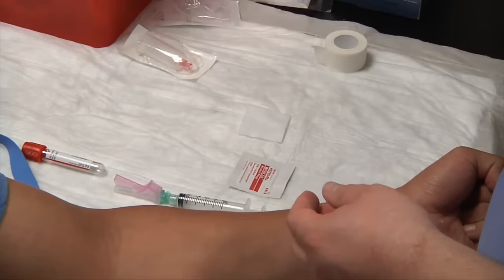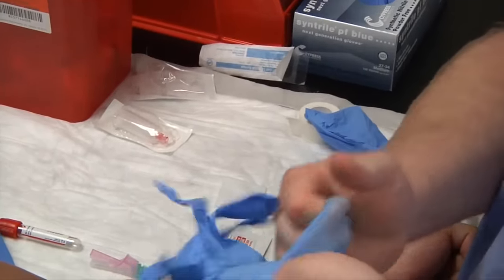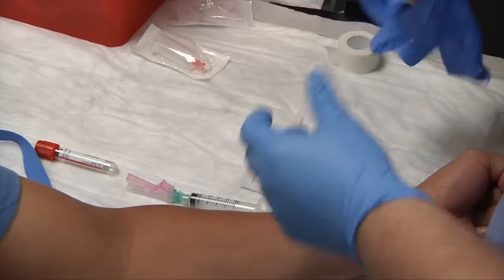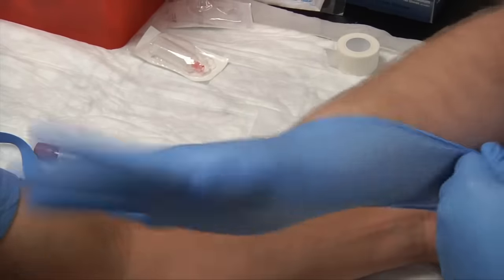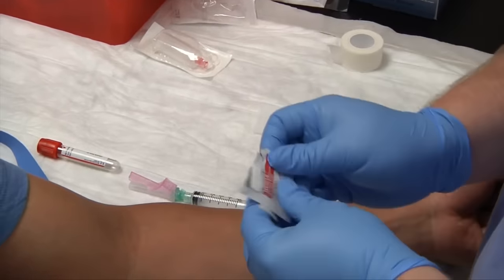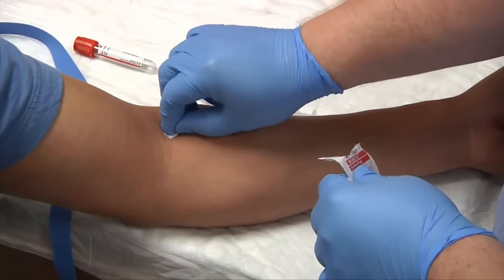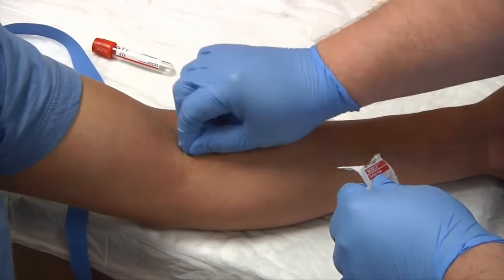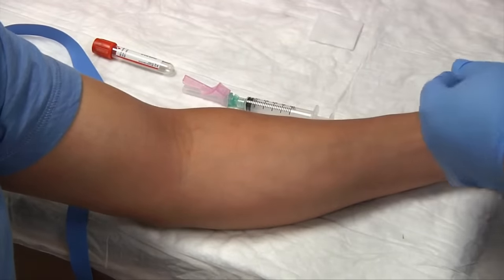We'll go ahead and apply our gloves now. We'll cleanse our patient right before we put our tourniquet back on — start in the center, use the concentric circle method inside out, then place to the side.